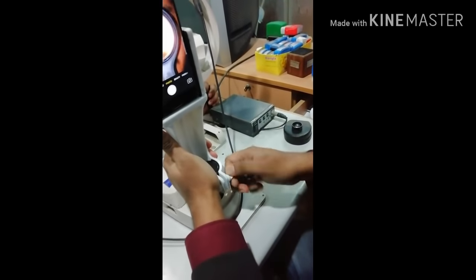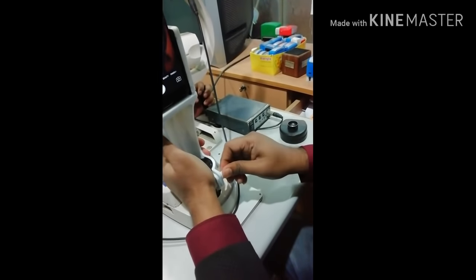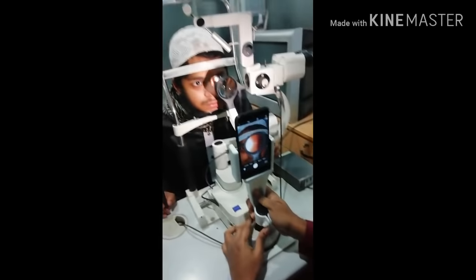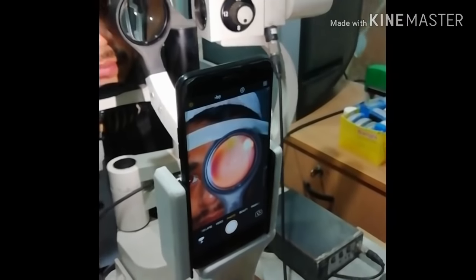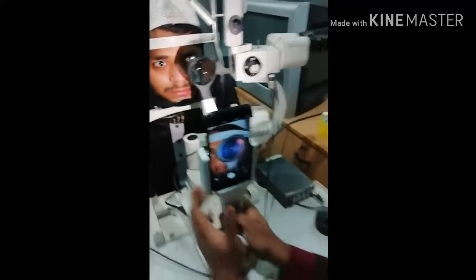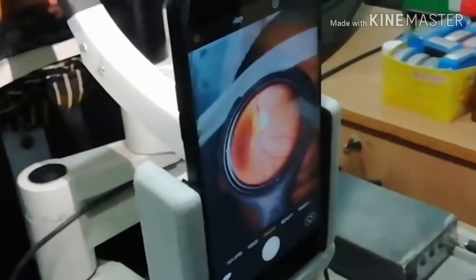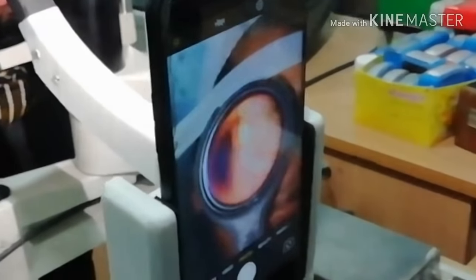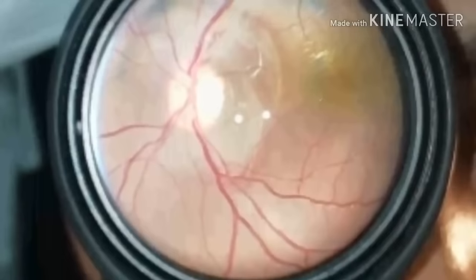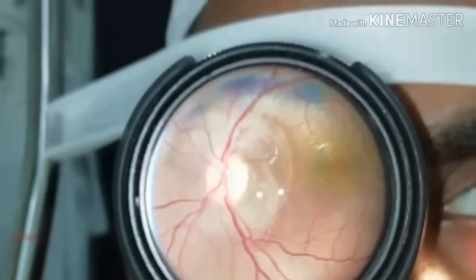After adjusting the distance, we can take pictures. We can mount this device with any slit lamp microscope joystick, then focus the retina easily using the joystick, and after that take a snapshot just like a color fundus photograph machine.